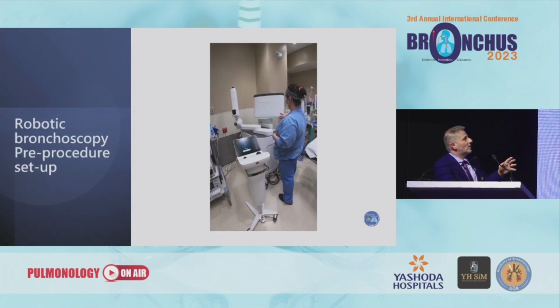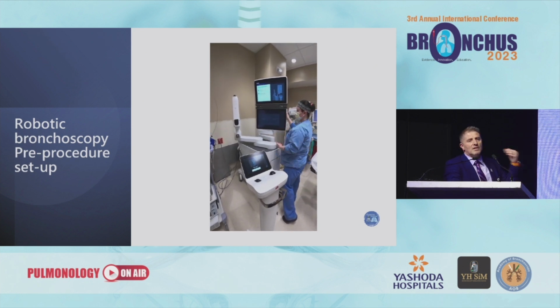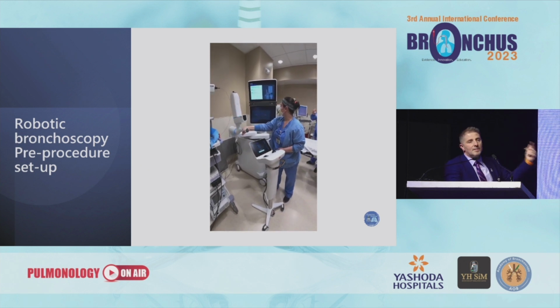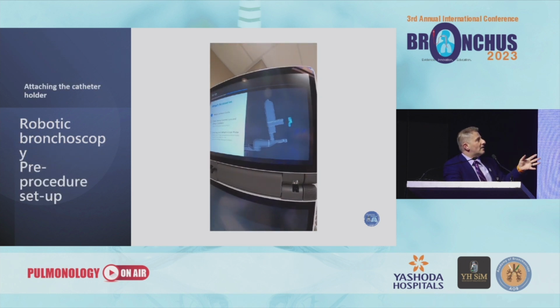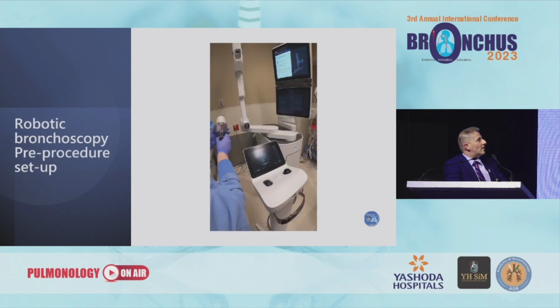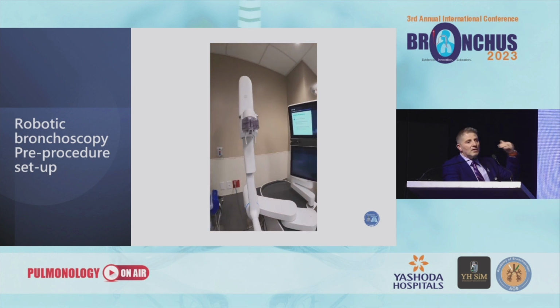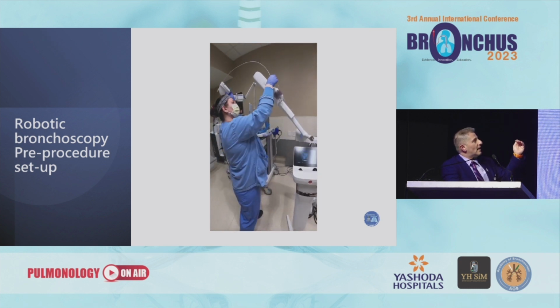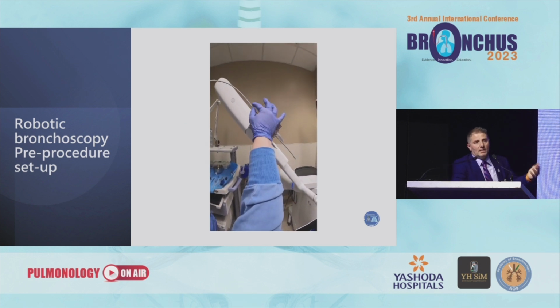And this is a quick video showing how a day starts with the setup. All the instructions come from the robot itself. If you open the screen and put it on, then the steps show up. I will go quickly through the steps that come up: connecting the catheter connector first, and then advancing to putting that catheter connector on the machine. And then it will give you the next instructions, which is putting the catheter in the right spot and connecting it to the arm.